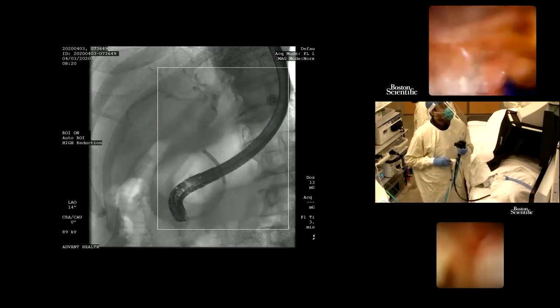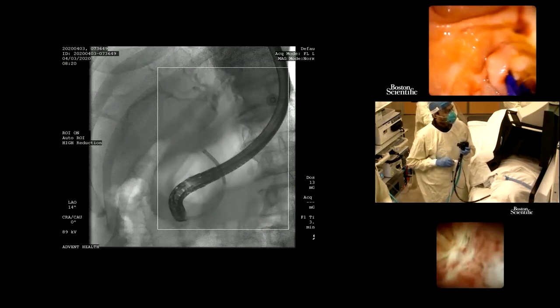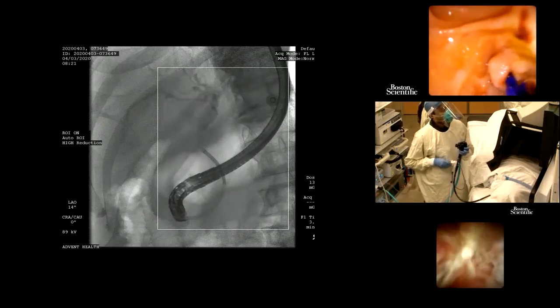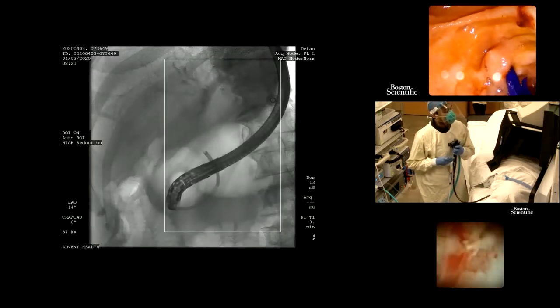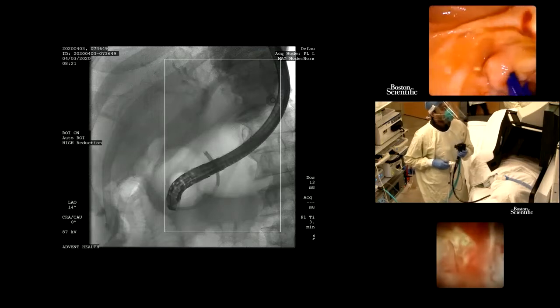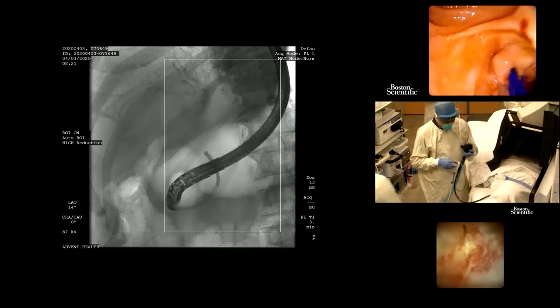Beautiful. And what I'm going to do is just irrigate, washing. Image, Stephen, please. So I think that is the tumor. Fluoro, please, for 1 second. Excellent. I can go higher if I want to, because there was a 10 French stent in place. But I think I'm able to see the tumor pretty well. It's fairly vascular, as we can see, and it's fungating. So more than likely, this has to be a cholangio-CA. We just need to get enough tissue from this.